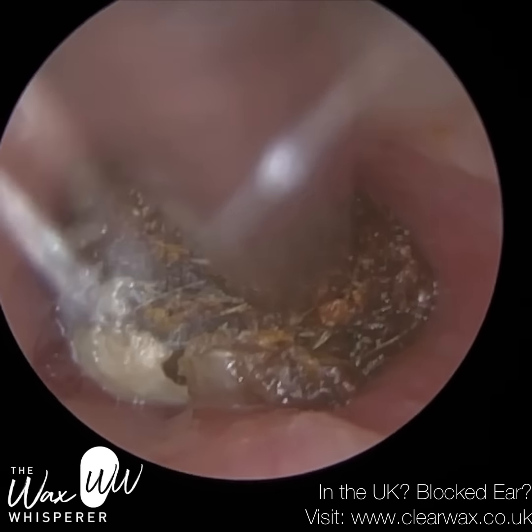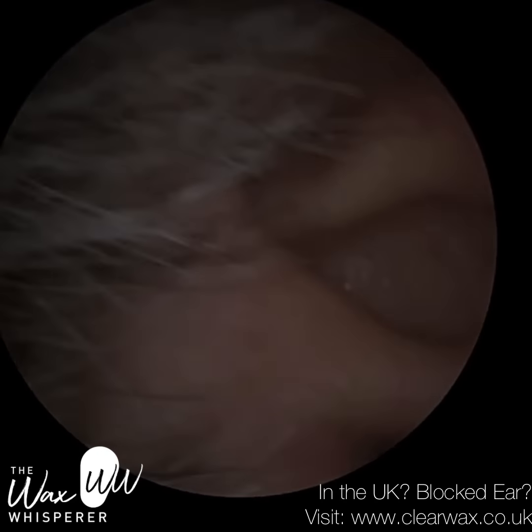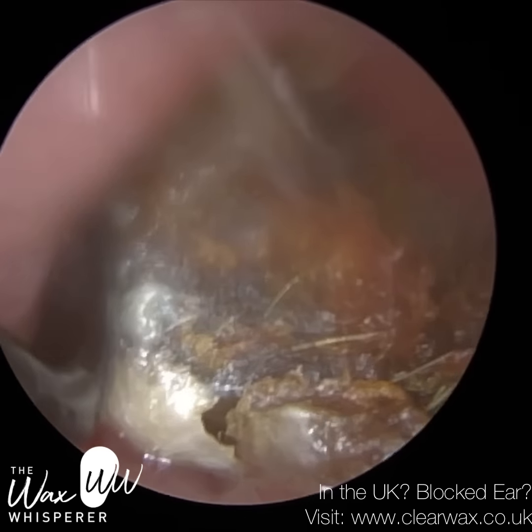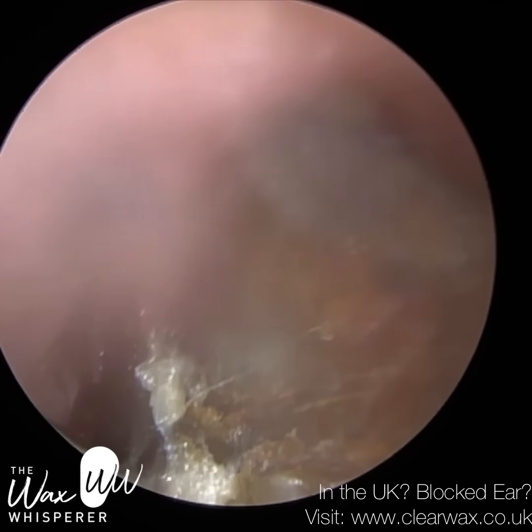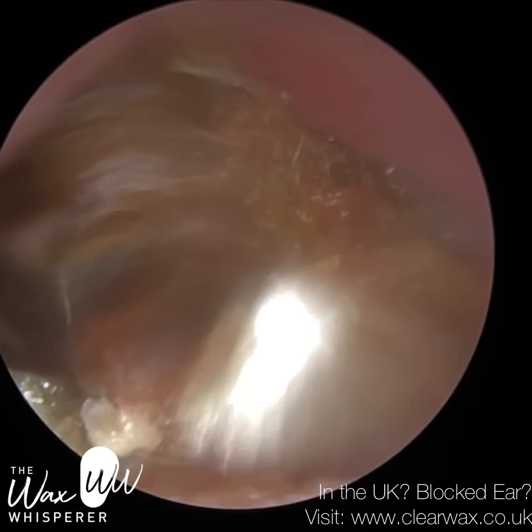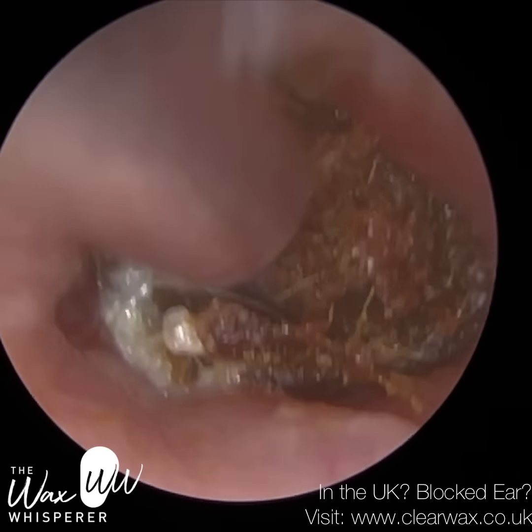You can see it's coming forwards, but it's hitting that protrusion, that front part of the ear canal that's protruding outwards, and that was also becoming a bit painful for the patient, and it's rubbing against that. So once more, I'm going to go into the hook. I'm gliding it over, beyond, so I'm just flicking it forward so I can get behind. Now I'm into it, I'm in the core, and I'm thinking, brilliant, again, I'm going to get this out. And once again, it just dissected through it. It's got this chewing gum consistency. It's almost stretchy and stringy.